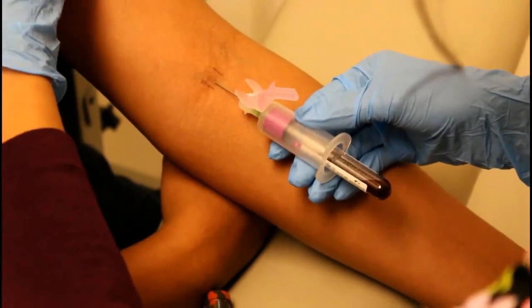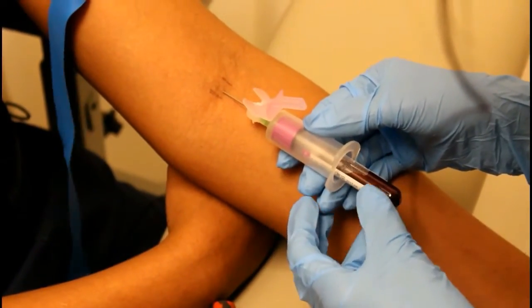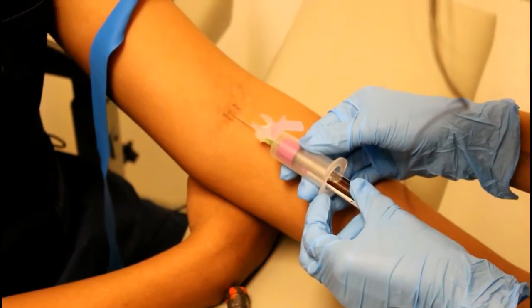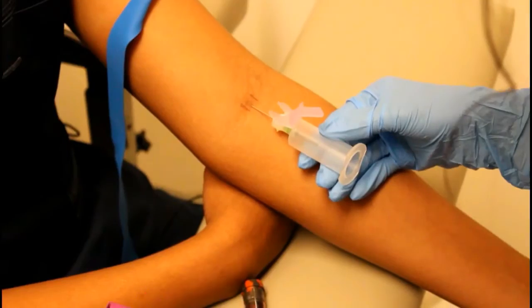In the middle of the last tube, remove the tourniquet. Finish and immediately invert the tubes 10 times. Do not shake.